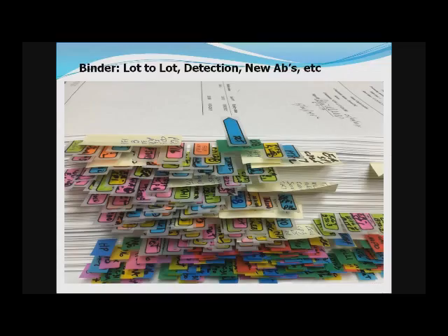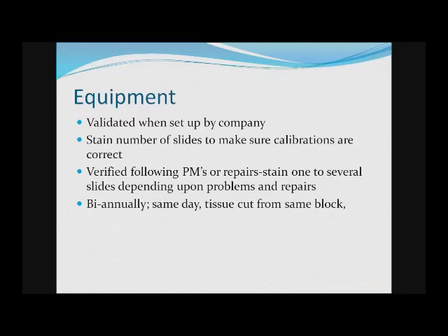And also, it can be very difficult to keep track of when this detection system or when this antibody was validated. So this is just an easy way for me to be able to find when P40 was validated, when IDH1 was validated, and use little markers.